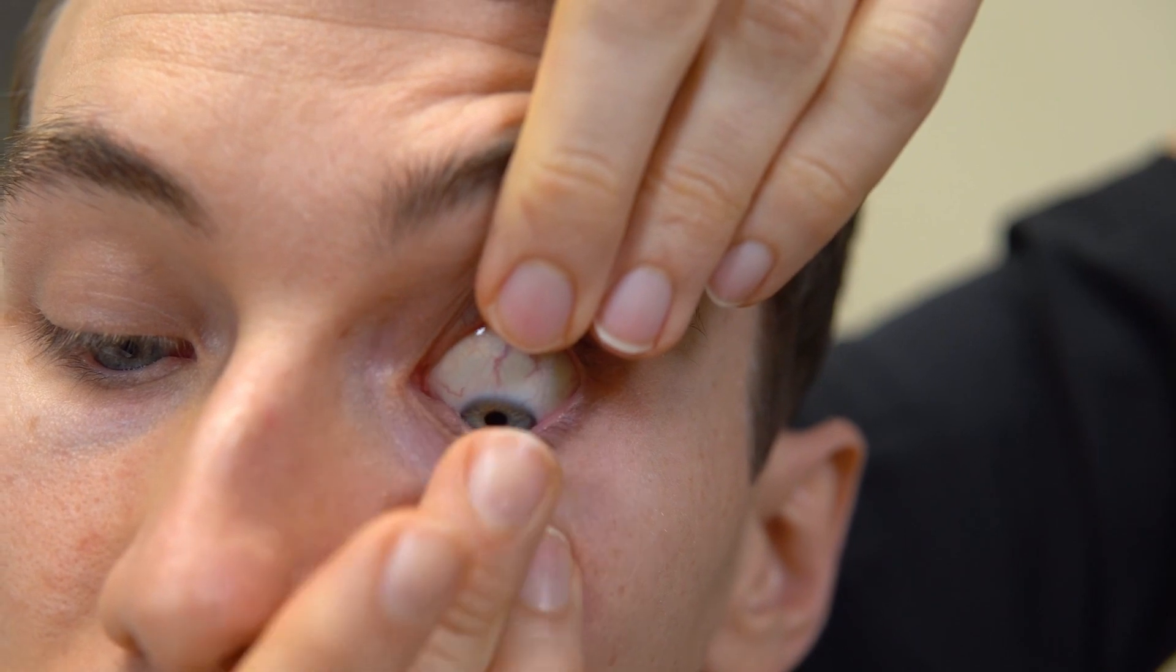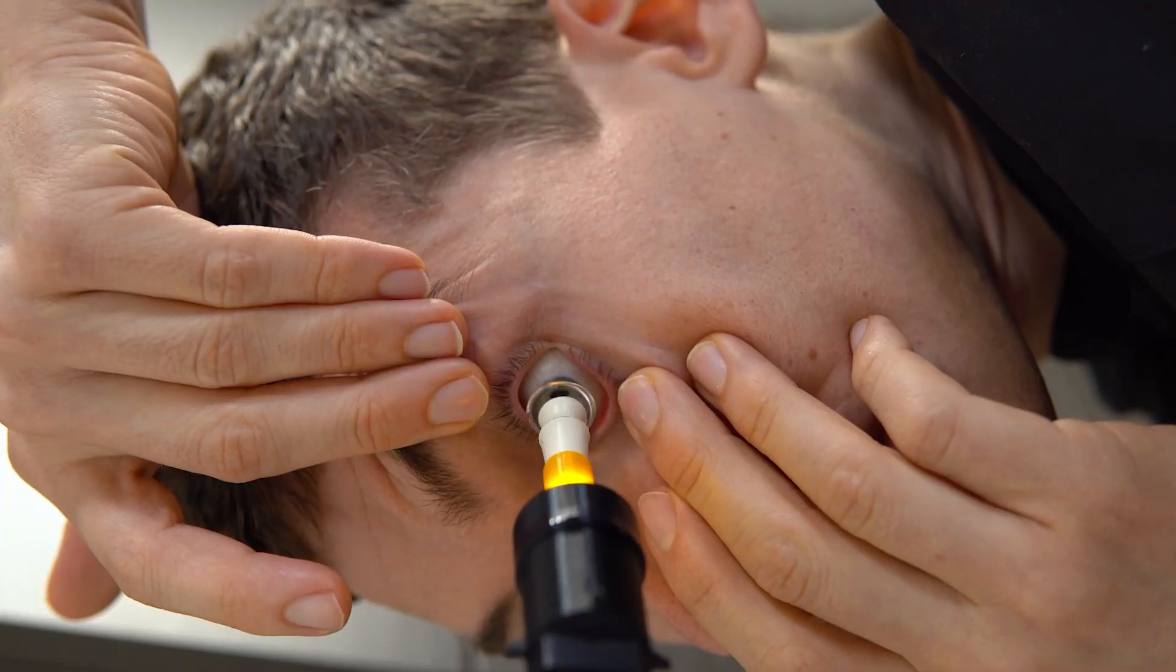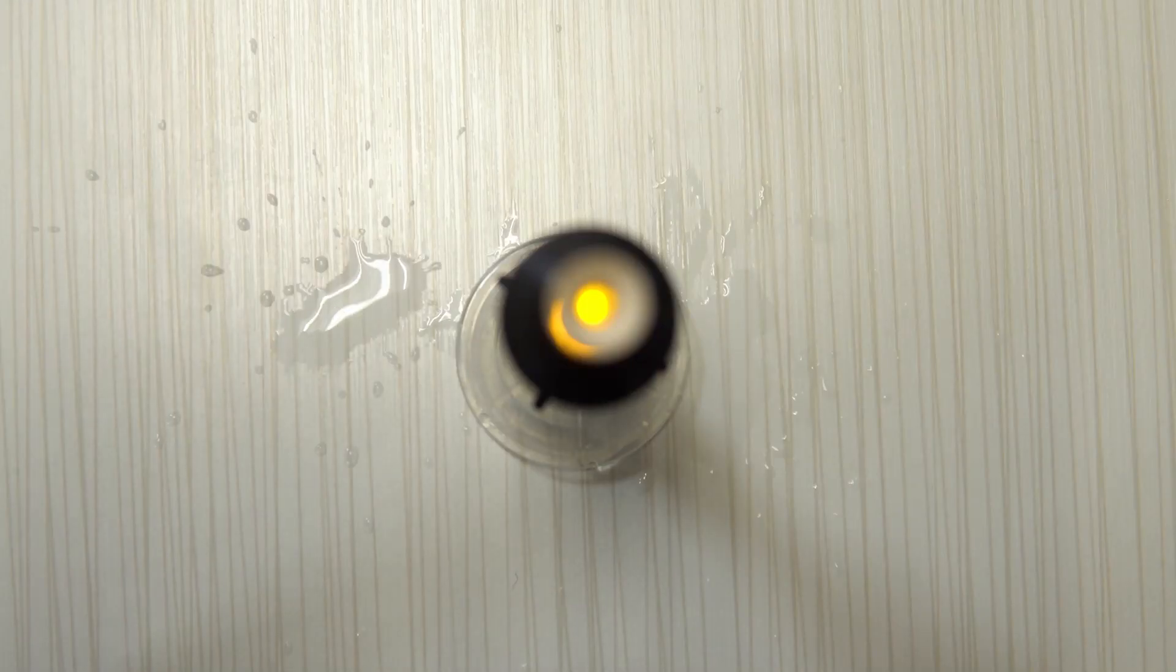The most common challenges that patients face while inserting these lenses includes holding the eyelids wide enough apart, spilling the saline solution during the insertion process, or getting air bubbles trapped under the lens. The S5 lens insertion system was developed by Dr. Faiz Majhoub specifically to address these challenges which were often encountered by his own patients.